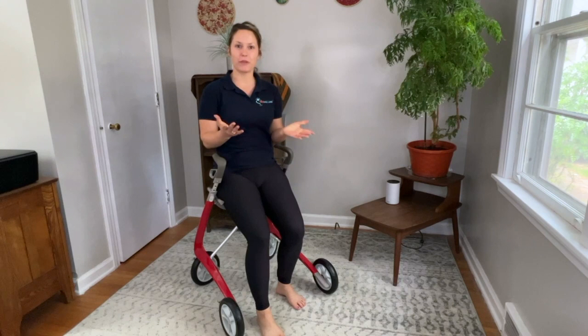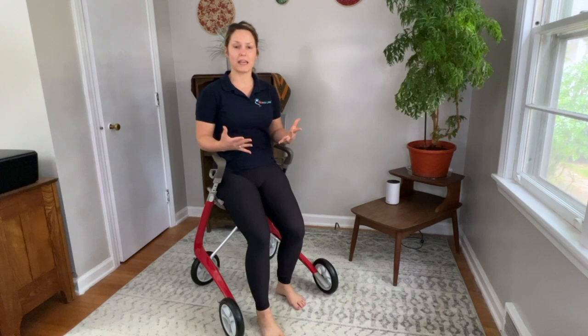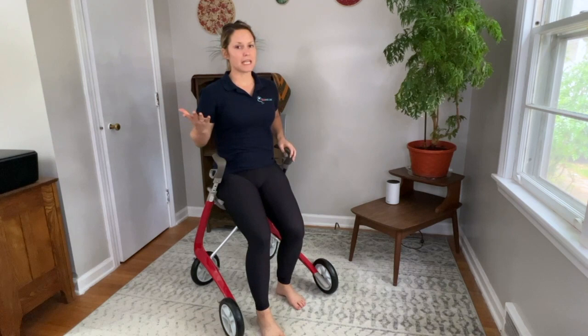I have a lot of clients who use a rollator for walking around, and the beauty of rollators is yes, it can help you be more stable while walking, but you can also do a lot of exercises from your rollator — some standing and some seated. Today, we're going to focus on seated.